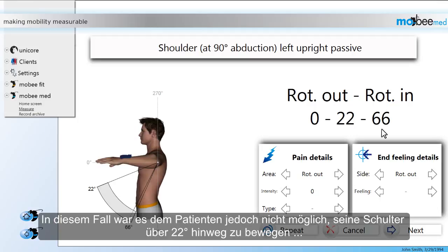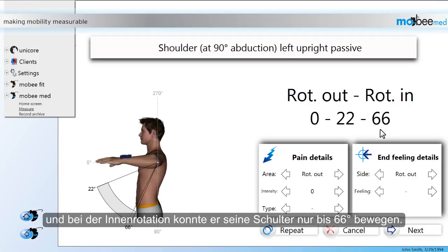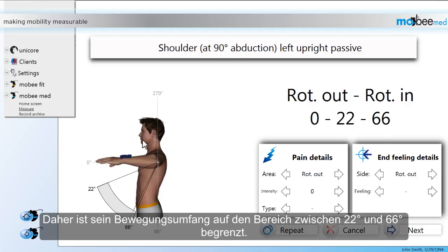However, in this case the patient wasn't able to move his shoulder beyond the 22 degree mark. And when it came to the inward rotation, he was only able to rotate his shoulder to 66 degrees. Therefore, his range of motion is restricted to the area between 22 and 66 degrees.